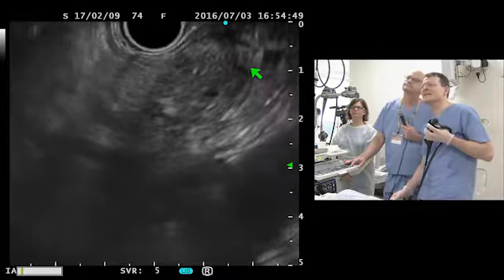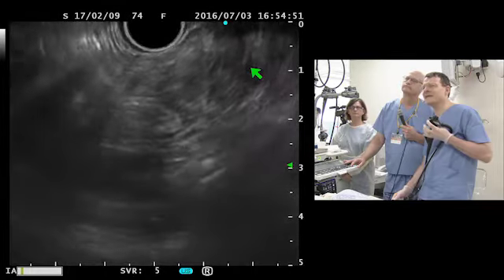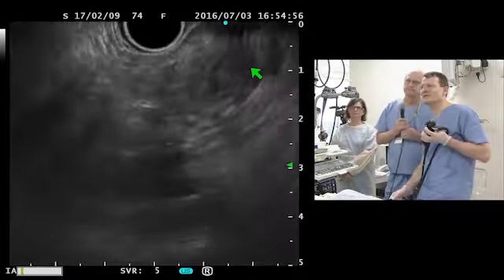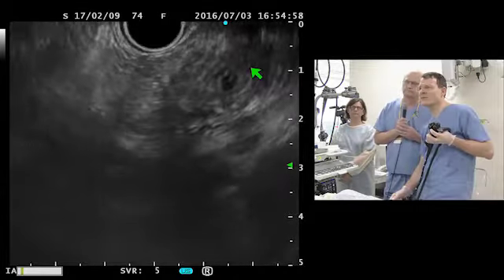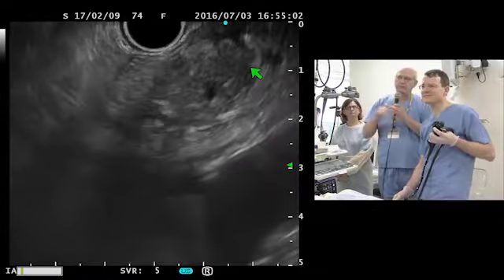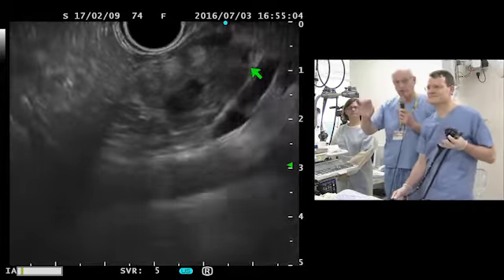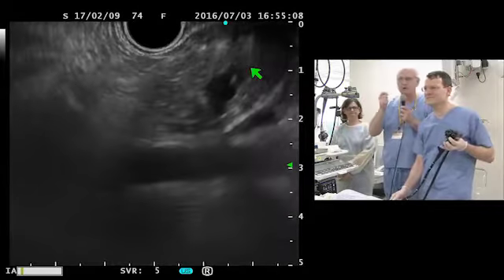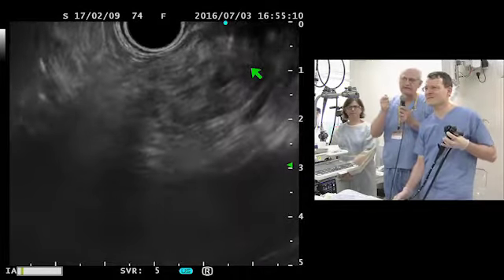So, what would you think? It looks a little bit edematous, or it is not really a regular pancreas? Well, I think that while the parenchyma is not normal, it is also not atrophied. And this is one of the findings that we have.